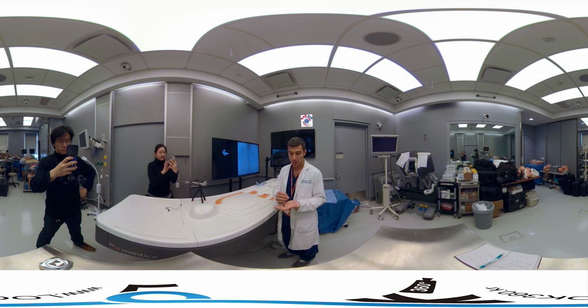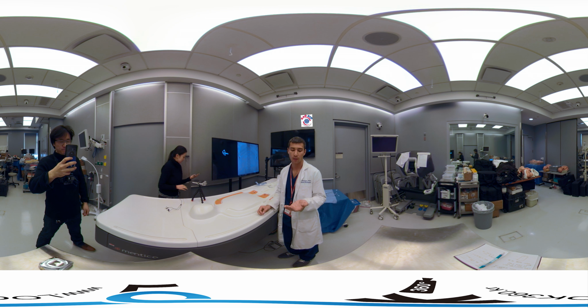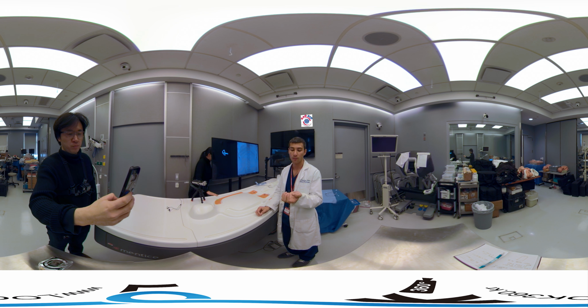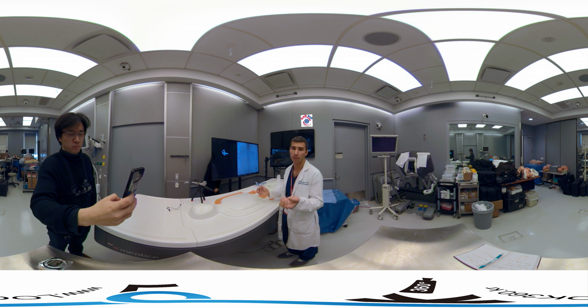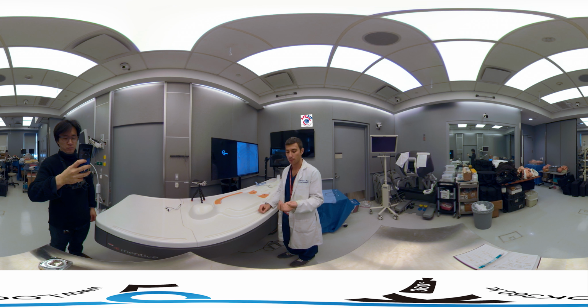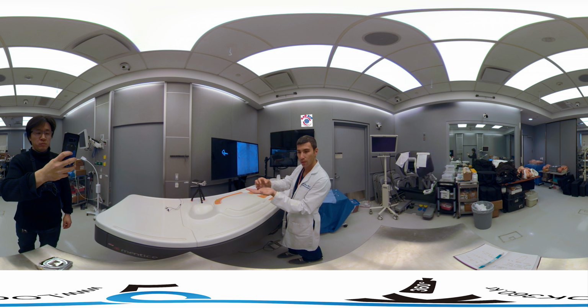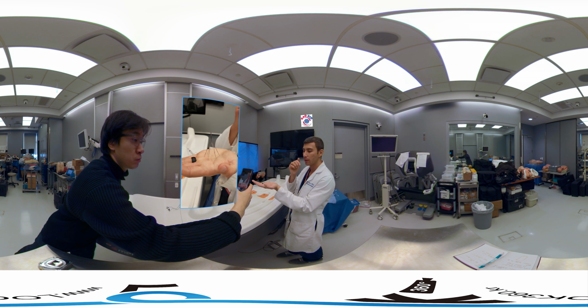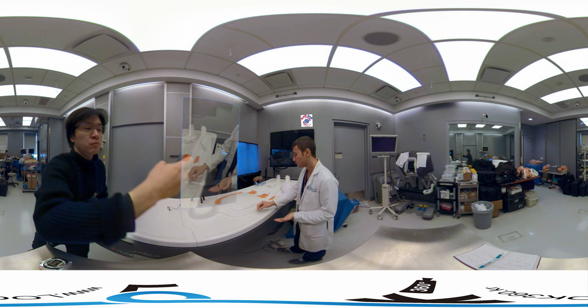The filters are placed for patients that can't get anticoagulation, that have venous thromboembolism or VTE. This type of filter that we're going to be placing today is retrievable. It's an option type, and it's designed specifically in this unit to be placed from the femoral access, but it can also be placed from the internal jugular access. This is what the filter looks like, and what it's designed to do is trap clot underneath it, preventing it from going from the legs to the lungs.